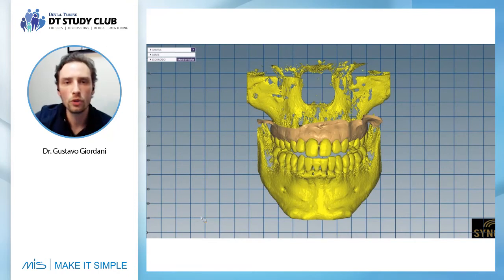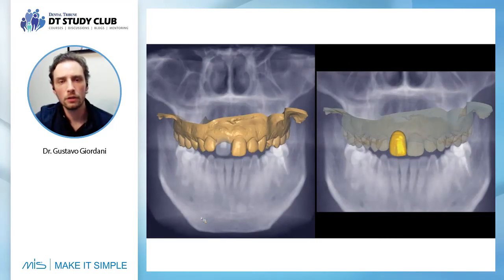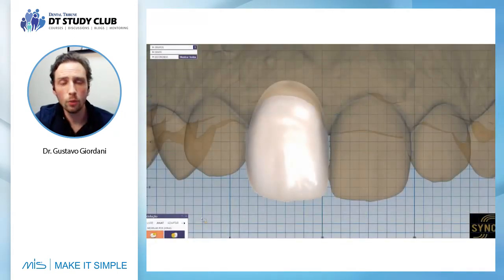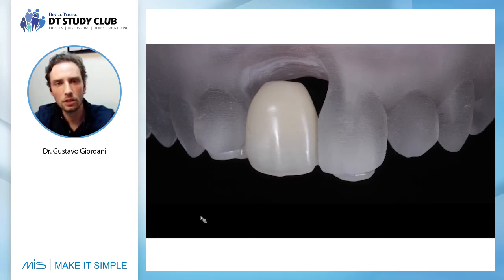The lab will superimpose those images again, CBCT inside the Invesalius software, transform into STL, then go to the exocad and superimpose the STL from the tomography and the STL from your models. They will remove the tooth inside the model, and then they will copy the tooth and copy the first millimeter of the root. By doing this, all the work will be done, and you're gonna get this provisional from your lab with a very good critical contour. And very important tip, ask your lab to do those wings so you can know exactly the perfect position to capture your provisional cylinder inside the mouth.